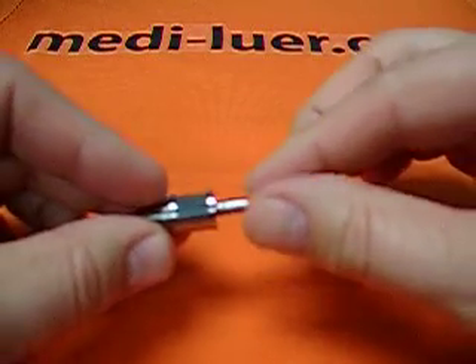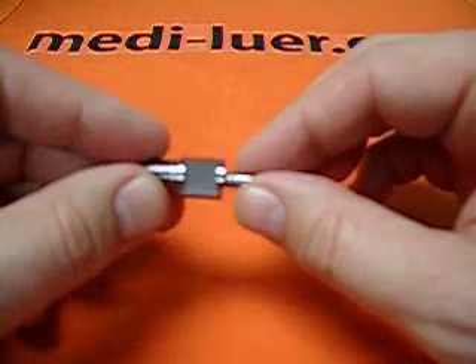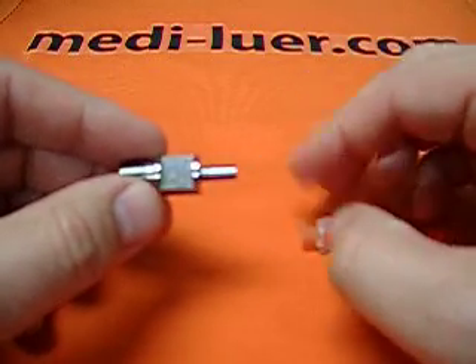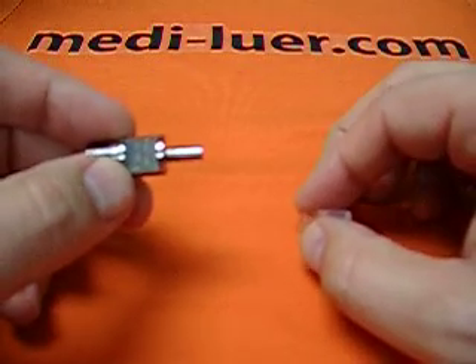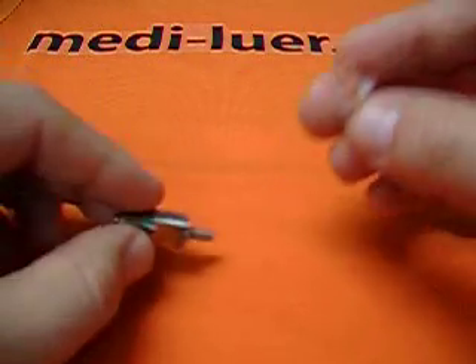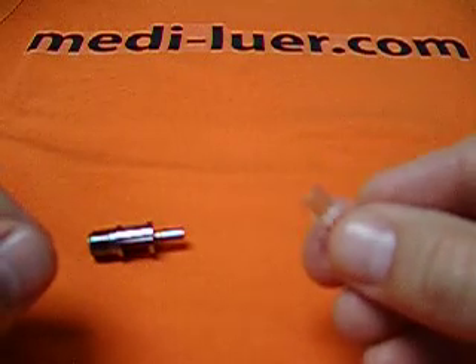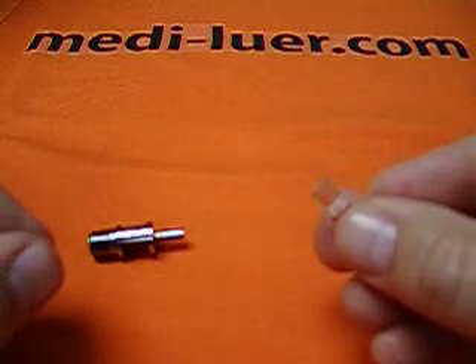What we're looking at here is an ISO 594/1 figure 5 reference fitting. And what we're looking at in this hand is an ISO 594/2 female fitting.